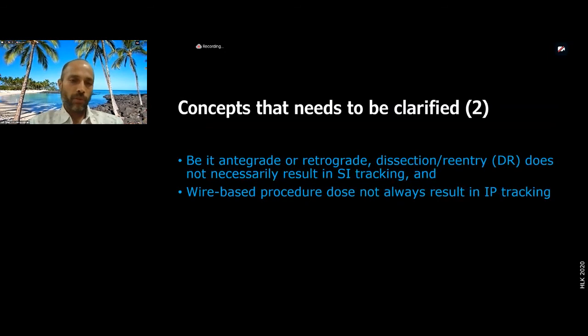And we also, for the most part, know today, and I'll support some of this with data, that whether it's antegrade or retrograde, dissection reentry does not necessarily result in subintimal tracking, and a wire-based procedure does not always result in intraplaque tracking.